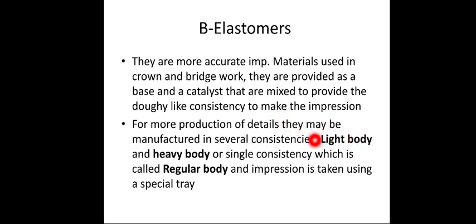Can be divided according to consistency and amount of filler into a delicate material, which is the light body, near liquid material, and we have the heavy body, which is a doughy material, and sometimes when it is used in one stage, it can be a consistency between these extremities, which is the medium consistency, which is called the regular body impression material.